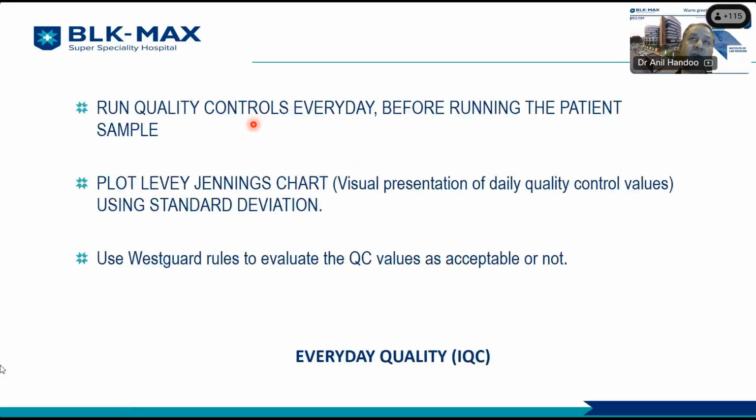Run your quality control every day before running the patient sample. It's an extremely crucial part of your activity in the whole day. Plot your Levey-Jennings charts before you start putting the patient samples on the testing. And fortunately, all this is now being done on most of the analyzers because they have software of their own and they have a QC channel in that which gives you all these values. And then finally, what is happening? You're expected to use Westgard rules or other rules which are available for us looking at the QC data.